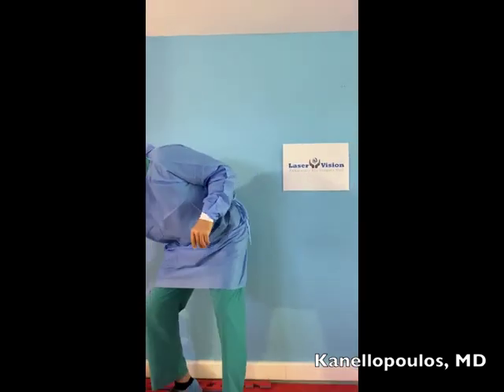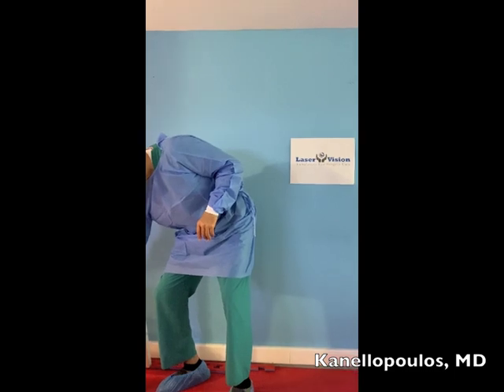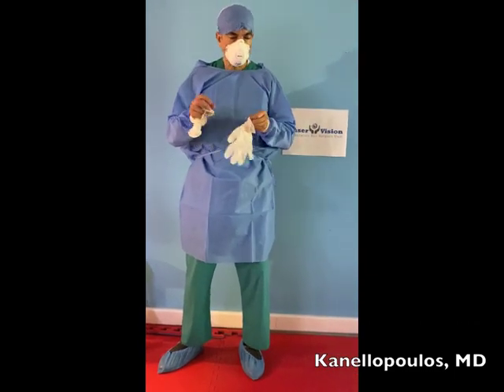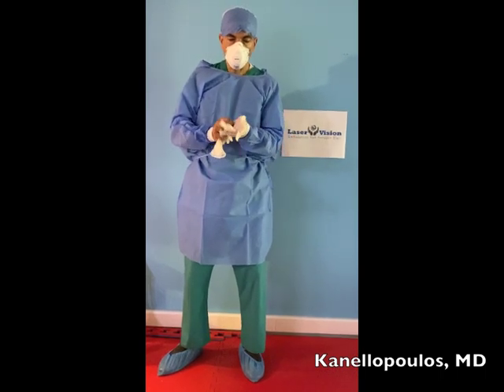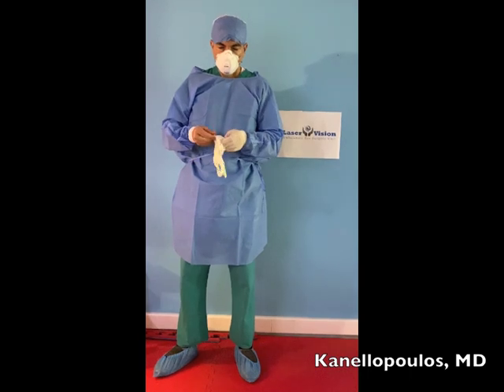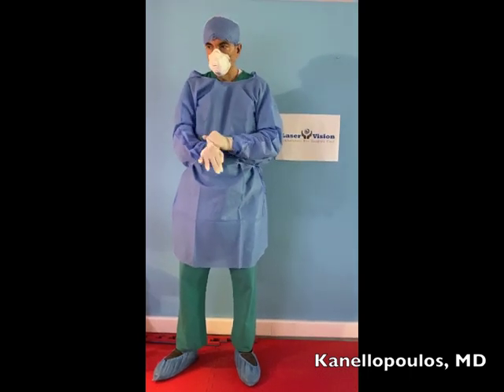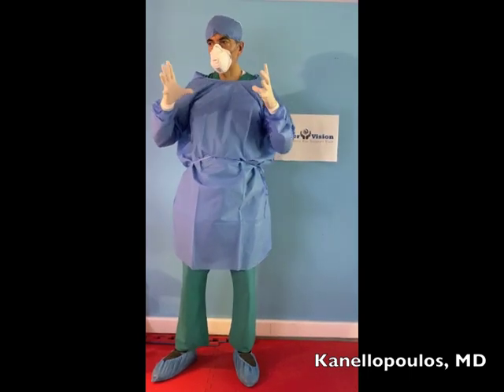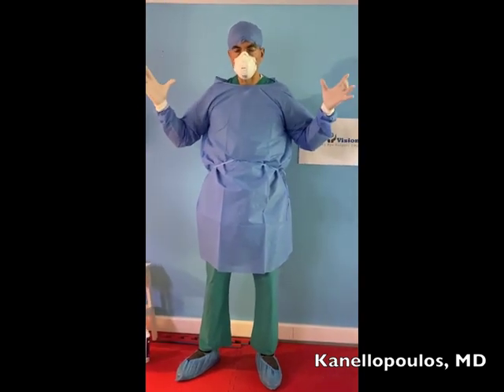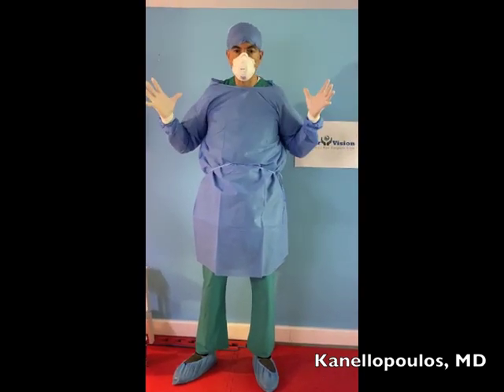Now I'm ready to put my gloves on. As I mentioned before, if this stuff is clean and new, it doesn't matter in which sequence I place them on. With the exception of protective glasses, I'm fully geared now. So I put on my protective glasses and I'm fully geared.